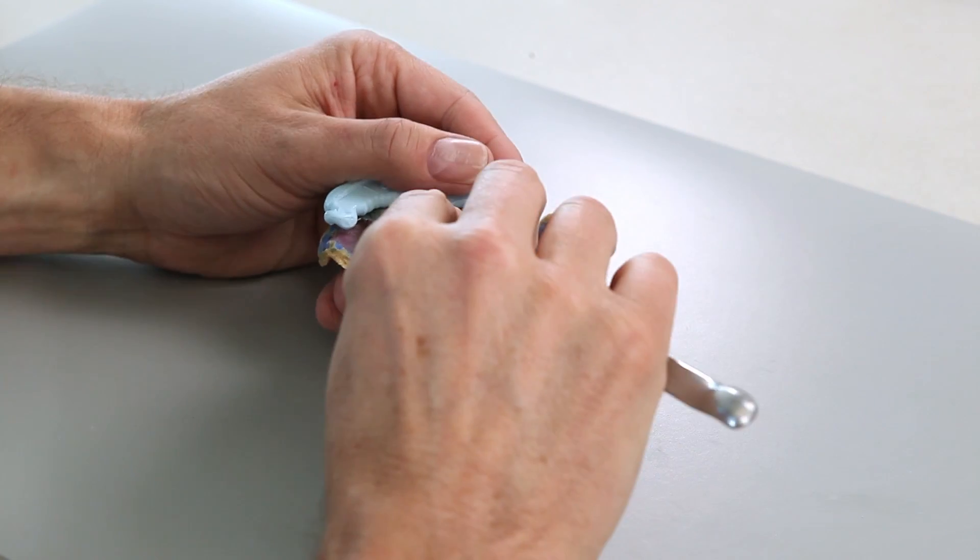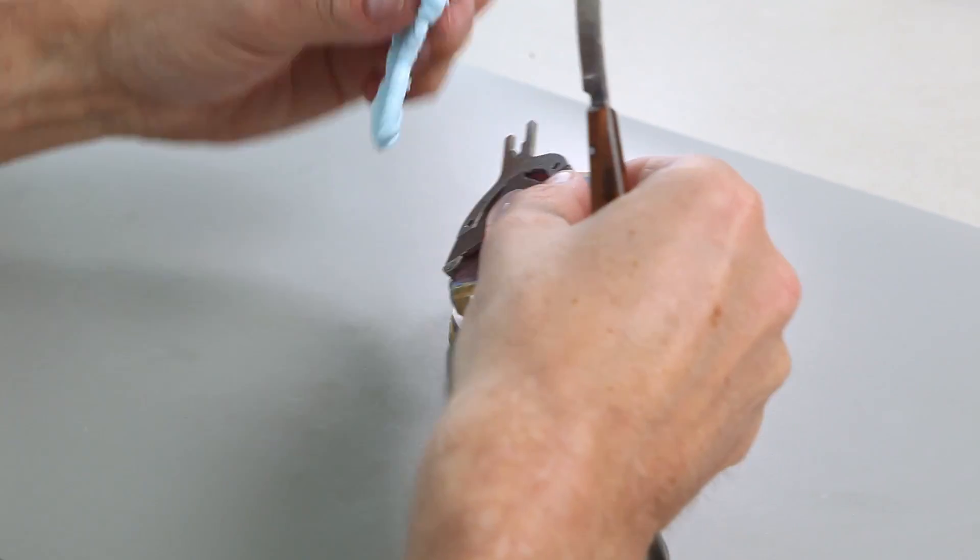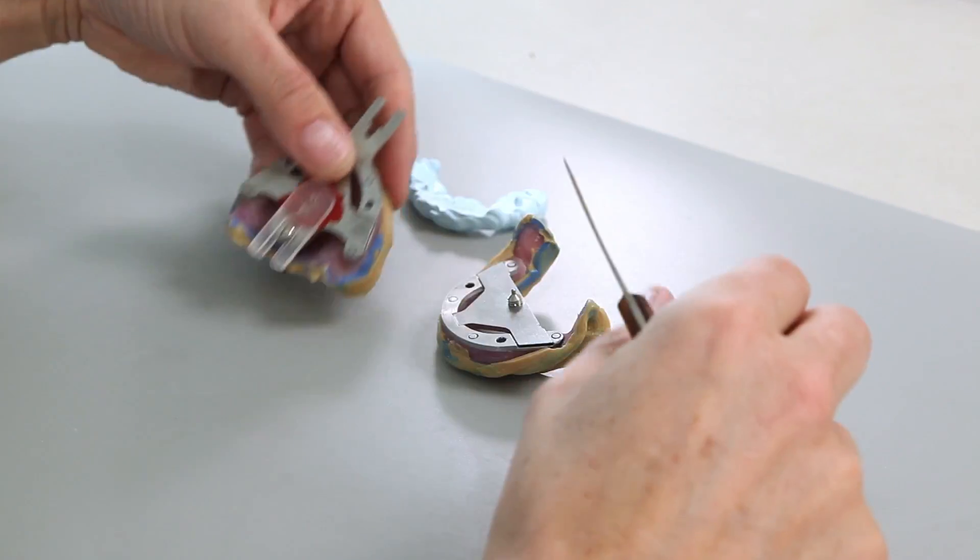After that, carefully separate the functional impressions and carefully remove the support pin registration plate.